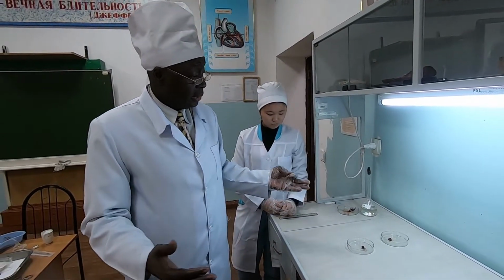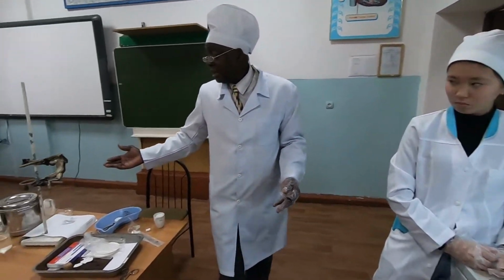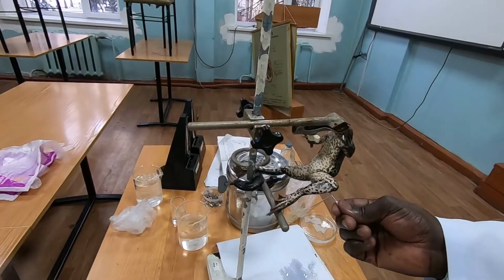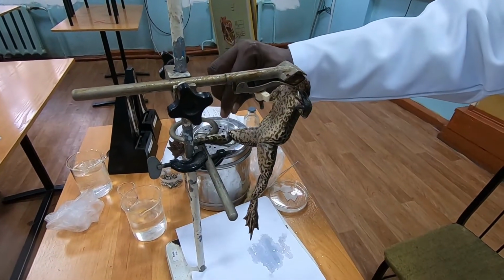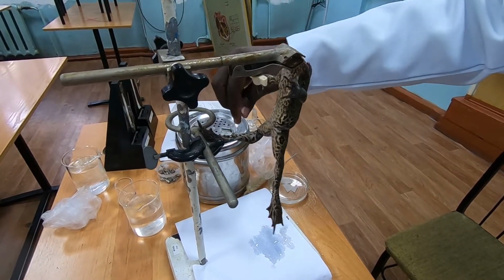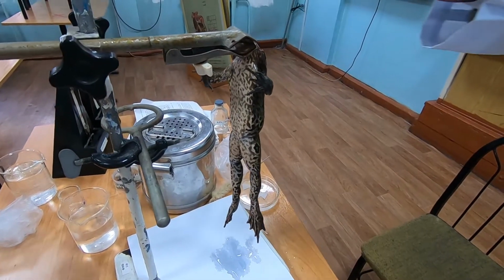So today, this is our work. And here you can see our frog is still reacting. It is not yet dead.